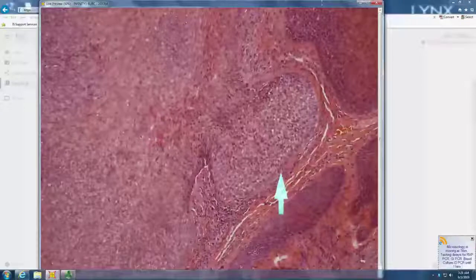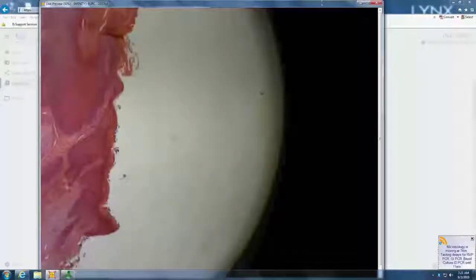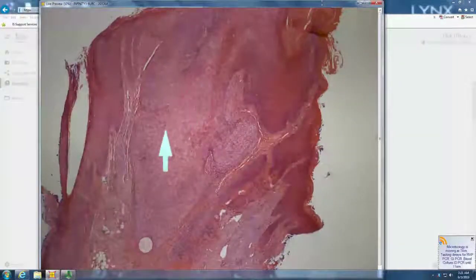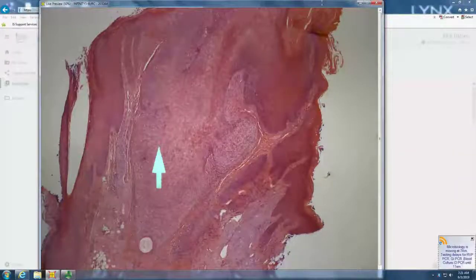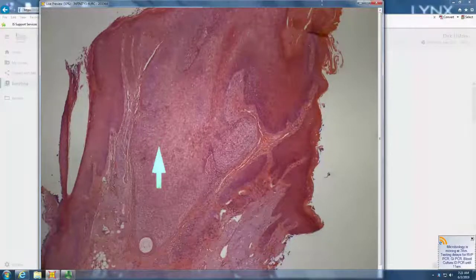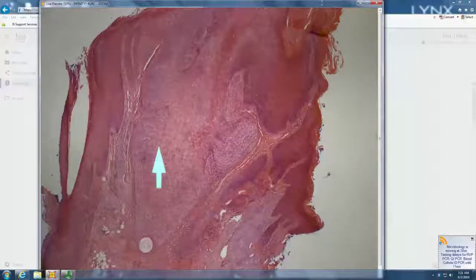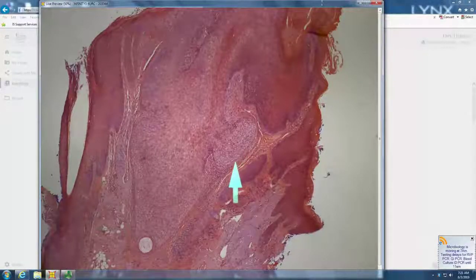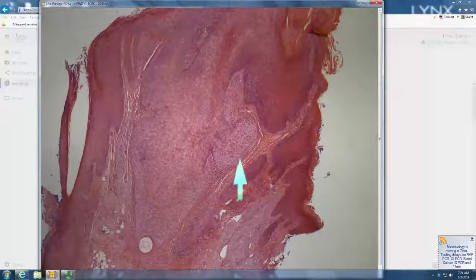So trichilemmoma. So trichilemmoma, they can be tricky. These trichilemmomas hang down from the epidermis as opposed to a clear cell acanthoma that is the epidermis. Right? Clear cell acanthoma is a segment of the epidermis. Trichilemmoma hangs down from an epidermis composed of pale glycogenated cells, peripheral palisade, thick basement membrane zone. When multiple, associated with? Cowden syndrome, correct.